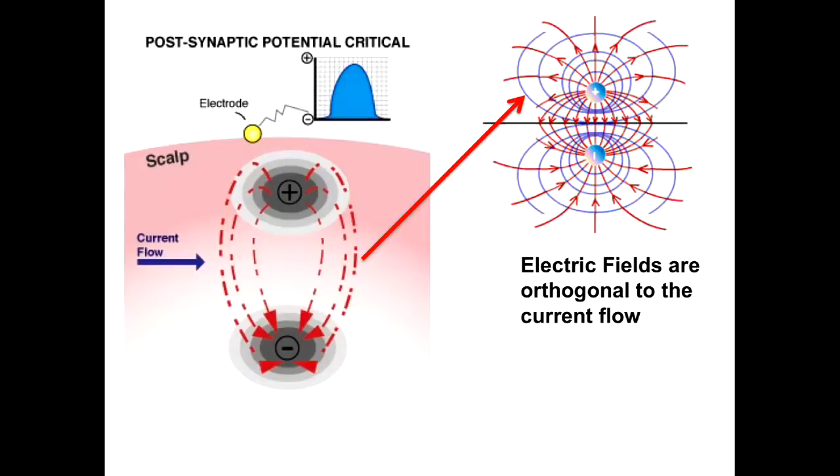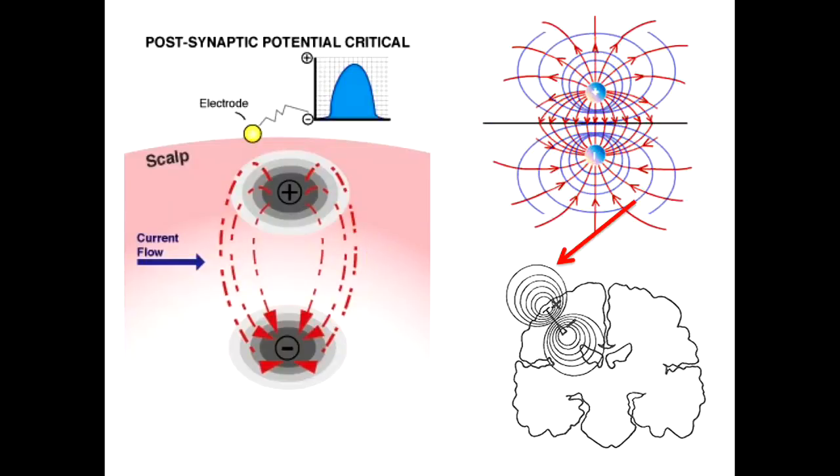So we're all generating these electric fields. That's basically what happens in your cortex. And if the electric field generation is right near the surface of the brain, we'll get a very tight distribution. I'll show you about what this is in a minute. This is a near field. So, for instance, if I'm trying to evaluate your spinal cord prior to surgery, and I want a measure of conductivity, I could electrically stimulate your foot or your hand, and I could drive your somatosensory system, and I can actually record very local field potentials right from your somatosensory cortex.